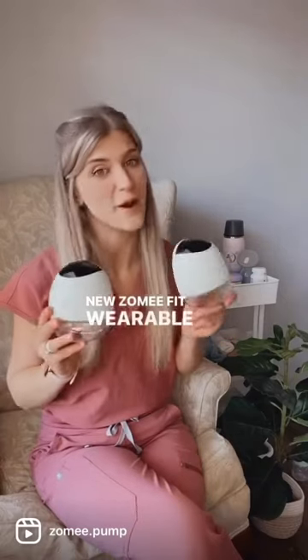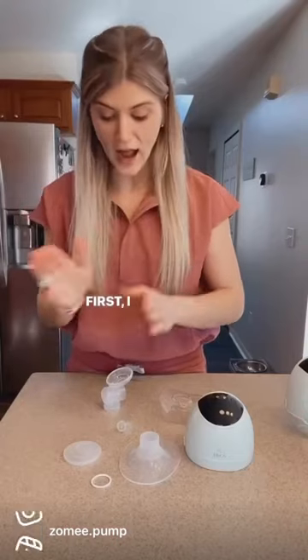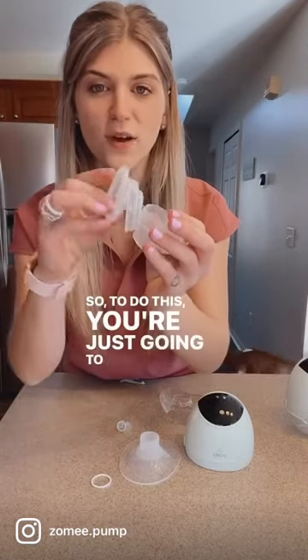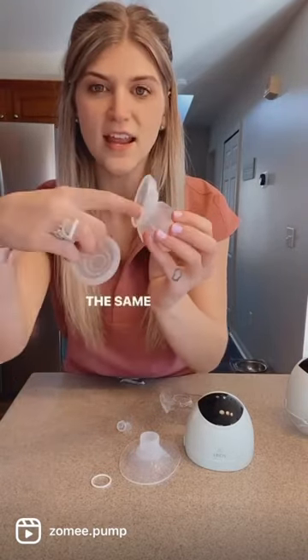How to set up the new Zomee Fit wearable breast pumps. First, take the pump body and the diaphragm. To do this, you're just going to align the curvature in the same way that this is.